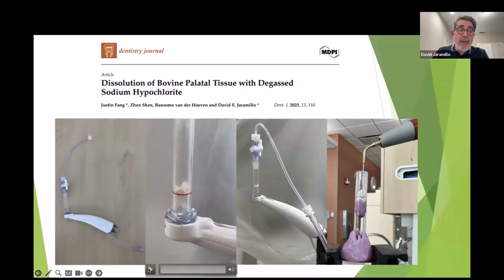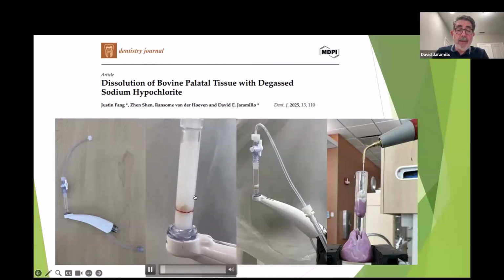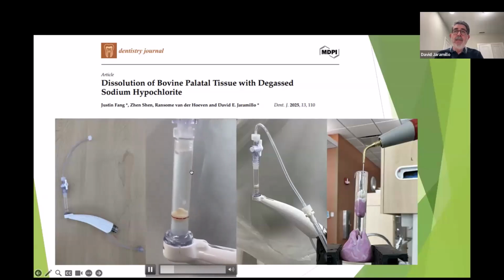And then we did it with 3% sodium hypochlorite and 0.5% sodium hypochlorite. So we will see here, I don't know if there's a sound. It shouldn't be a sound, but we can see the efficacy as you can visualize in the video.